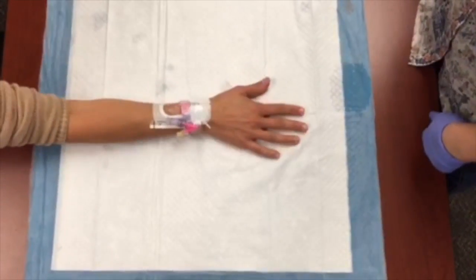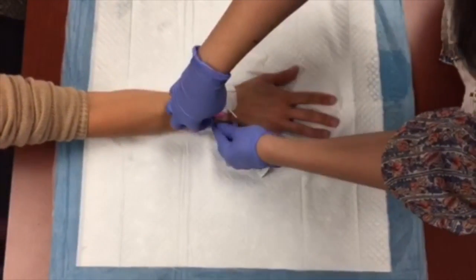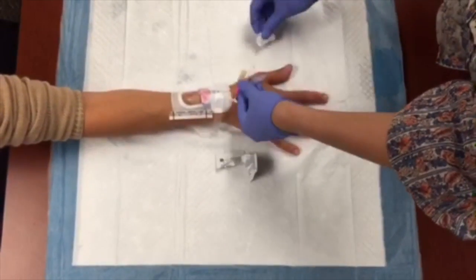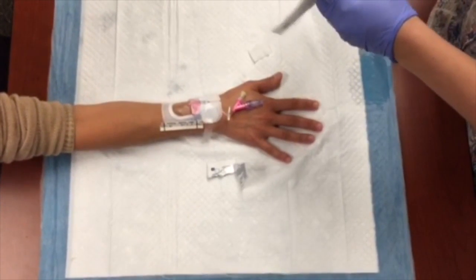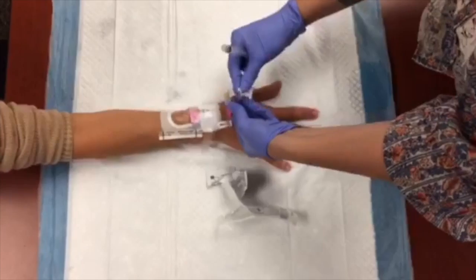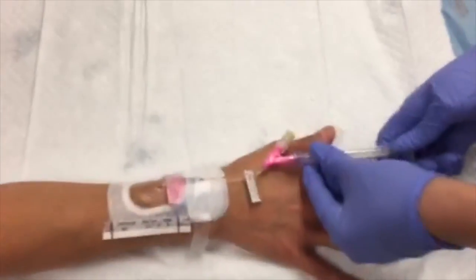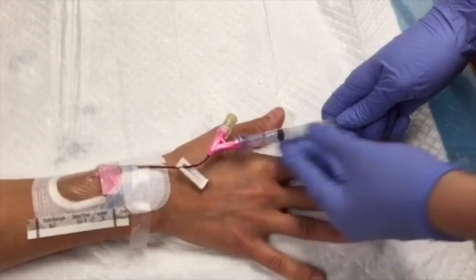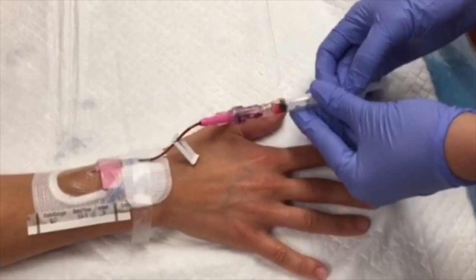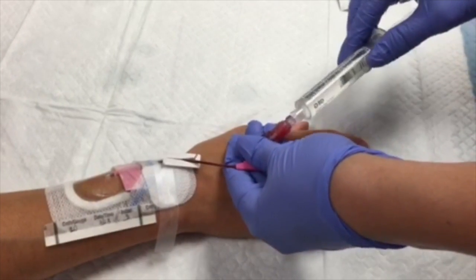With new line present, clean hub and prepare to aspirate dwell volume. Dwell volume is the volume of fluid in the IV, catheter, and hub. To do this, attach 3 ml syringe and slowly draw back until flash of blood is seen in syringe. This is the dwell volume. Flush line with normal saline.